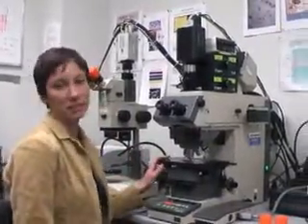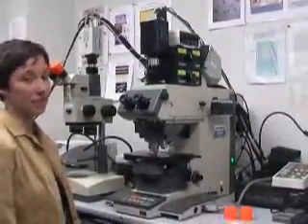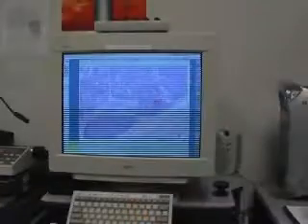We were able to tell which type of receptors were present in the tissue samples by which color they changed. The mammalian virus receptors were brown, and the avian virus receptors were purple. After staining our slides, we used this special microscope to view the color change in the receptors. It's a digital microscope that connects to the computer to get live images. Because the receptors are so small, we had to use a microscope in order to see the color change.